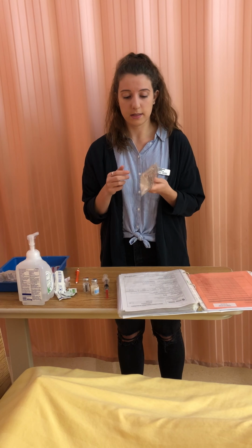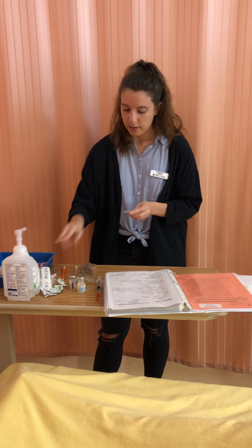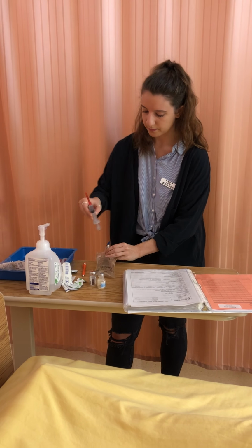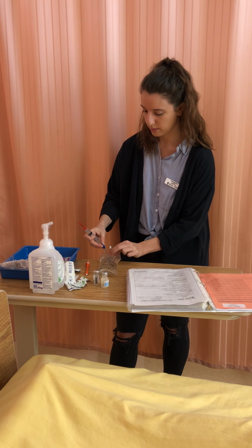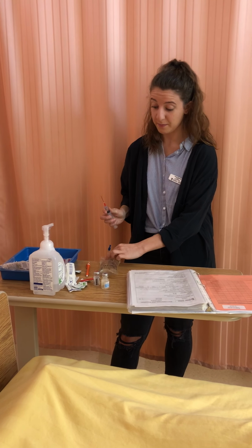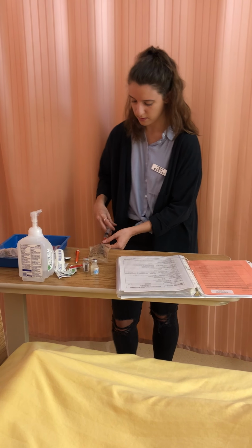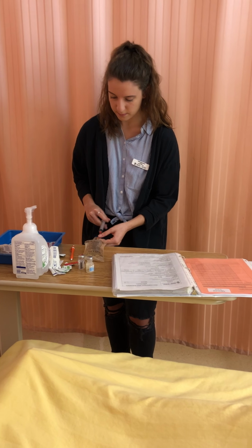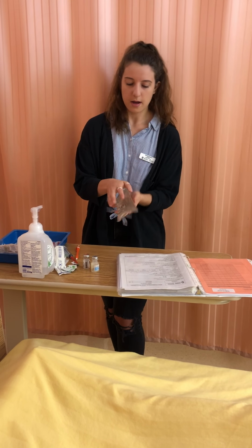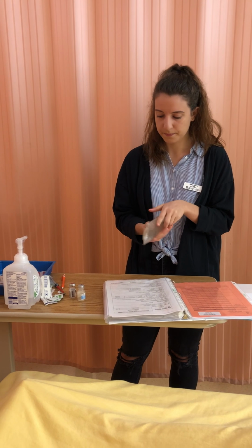This is not expired, the integrity is good, so I can use it. So I'm just going to swab the end of it for 30 seconds and let it dry for 15. I have not touched the end. I've maintained sterility, so I can put my needle in. Again, be careful not to touch either one. This would go into the sharps, and now I'm just going to gently roll this just to make sure that the medication disperses well.